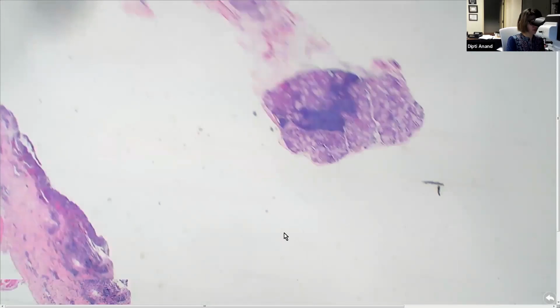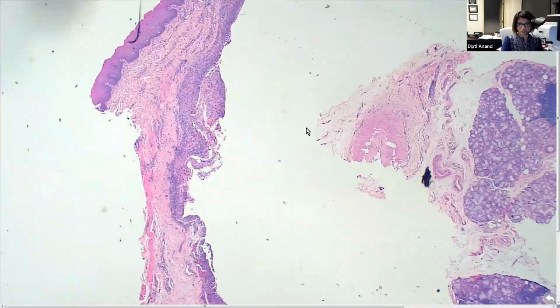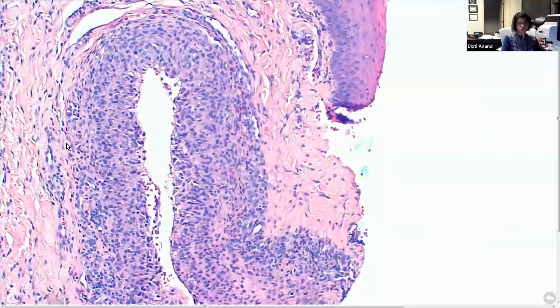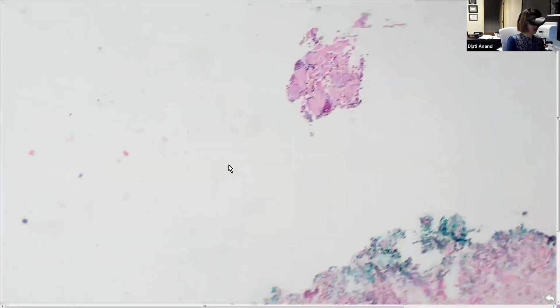Good. And then this is the 10B. Same thing. You have the mucosa, you have the salivary gland tissue with inflammation, but you don't have the mucin. But you have a space instead. And that space is the inflammatory space, and the mucin is inside the histiocyte. So even though you don't see mucin, the mucin is actually inside the histiocyte. So that's again a mucocele. Okay? Okay. These are subtle things, but they will get you, because then you will be arguing with yourself, I don't see mucin, then why is it a mucocele?